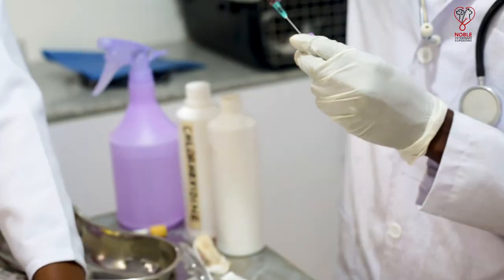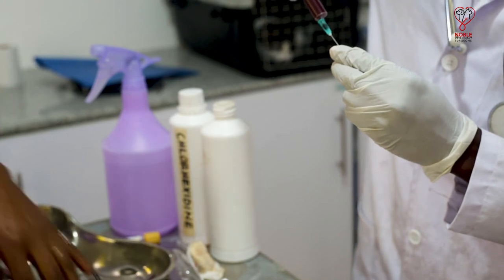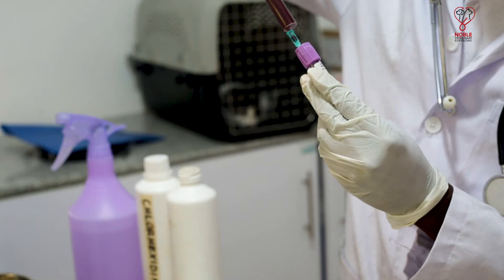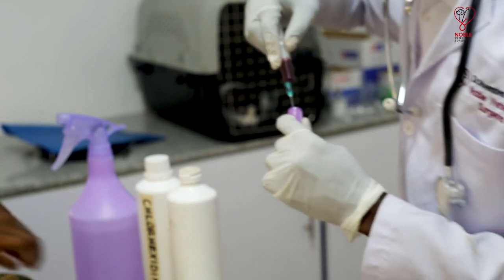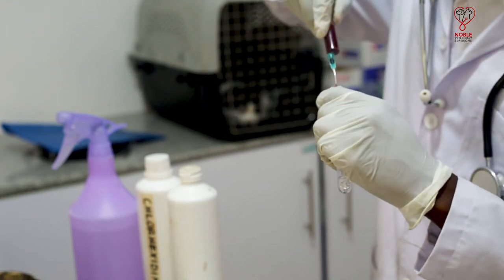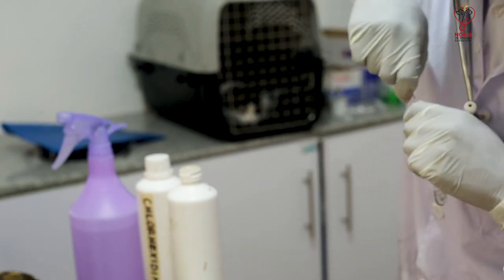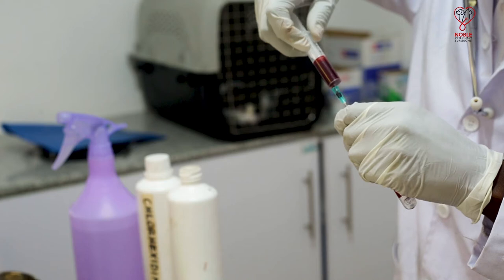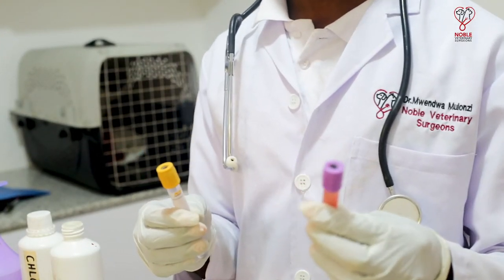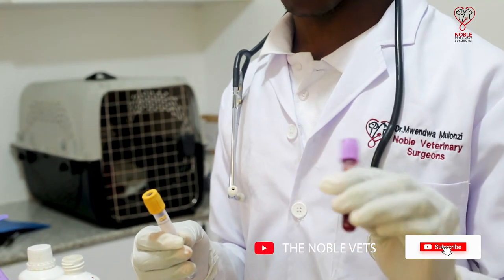After collection, blood is put into sample bottles. It is put into these two sample bottles — this one on my left is a sample tube that has an anti-clotting factor called EDTA. This will ensure that the blood remains as it is inside the animal's body.